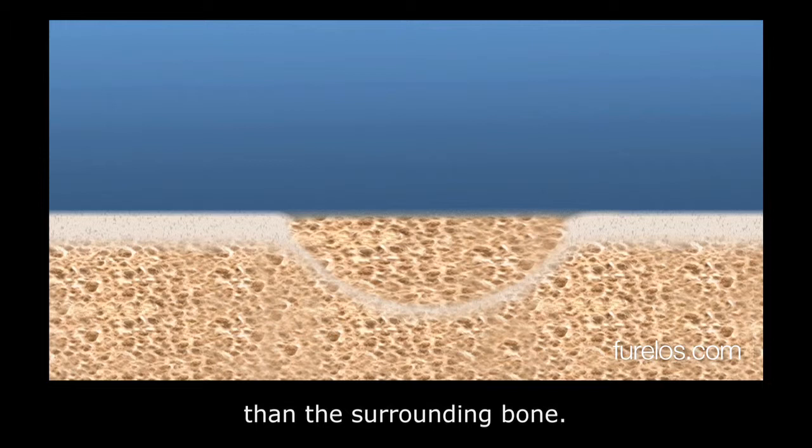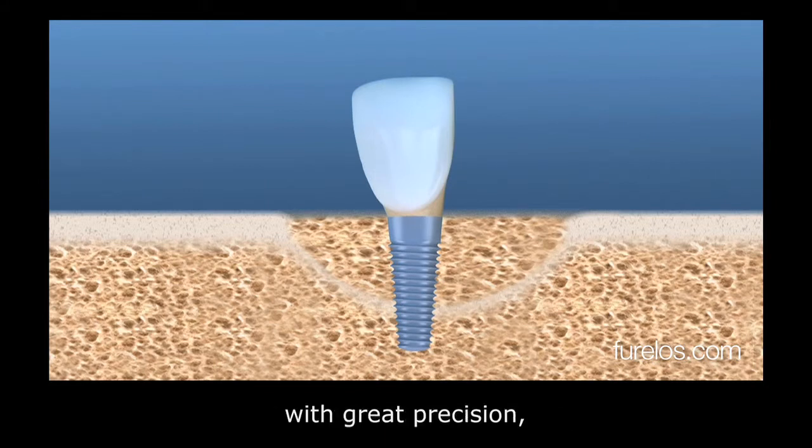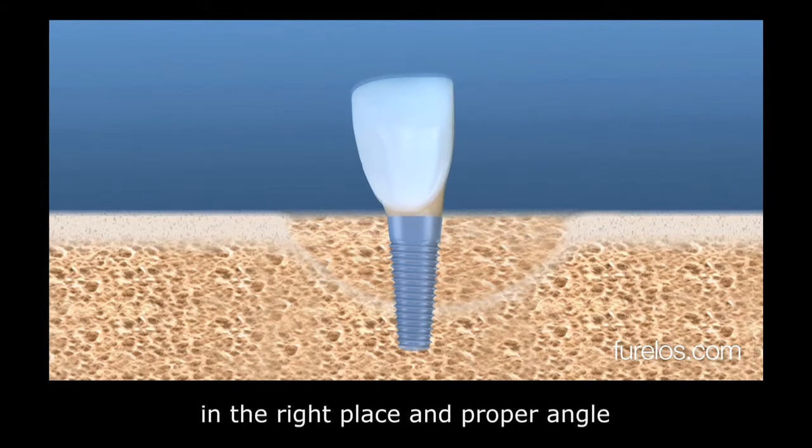This way, the dental implants can be placed with great precision in the right place and proper angle, this being essential for long-term duration.